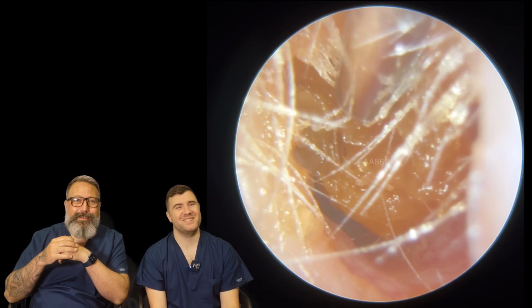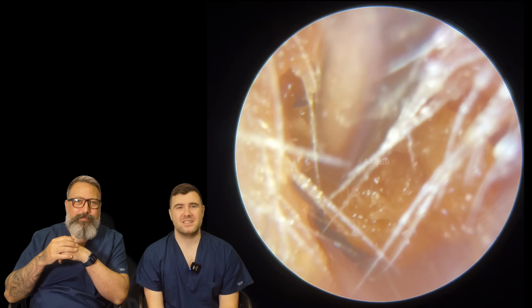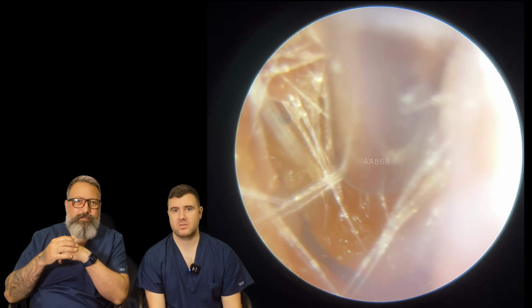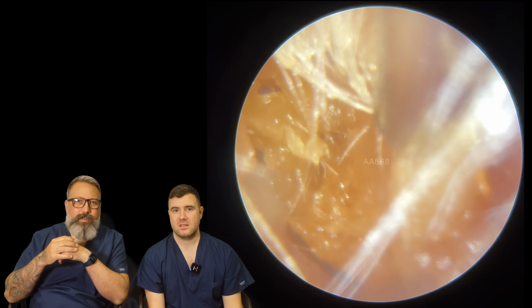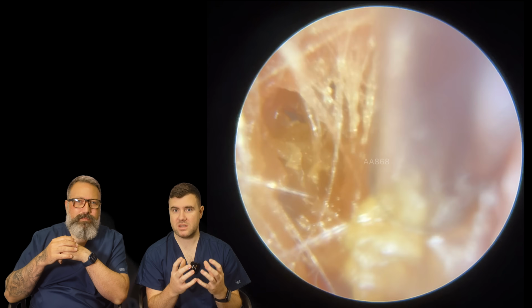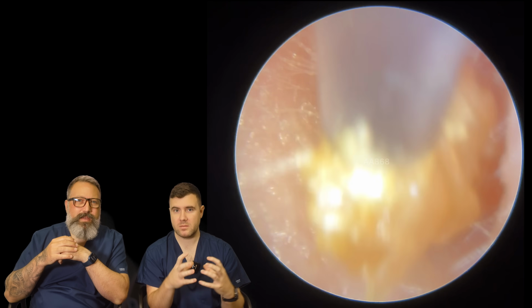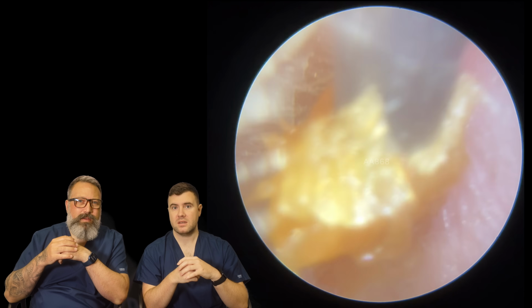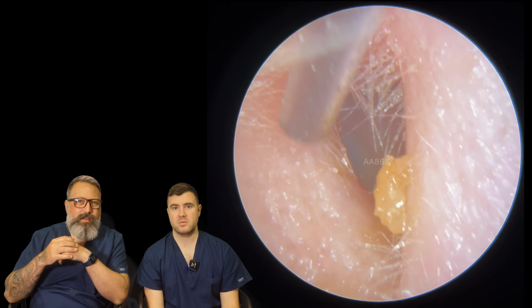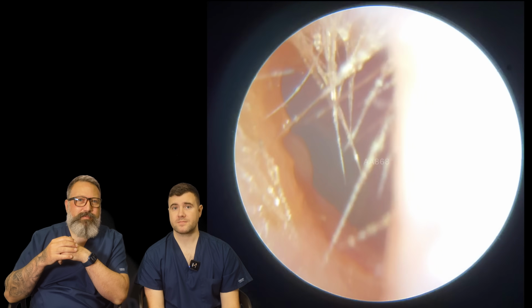I'm sorry, buddy. So we've got this drier, sort of deeper section. I honestly thought I was going to have some trouble taking this last bit out because the front section where the patient's been using oil was nice and soft, but you can see this last bit is all just kind of moving in one big piece. And that's a nice piece. Yeah, it came out quite easily for us. I was quite surprised with that bit. It almost looks like it was going to be a ribbon, that one, doesn't it?